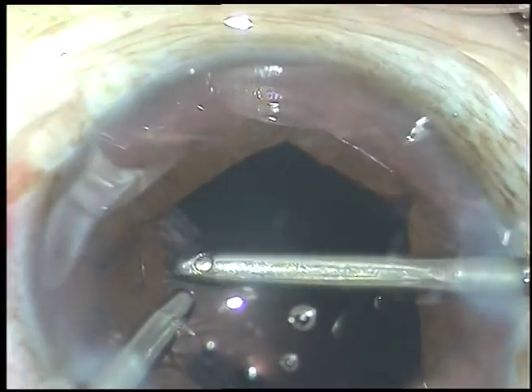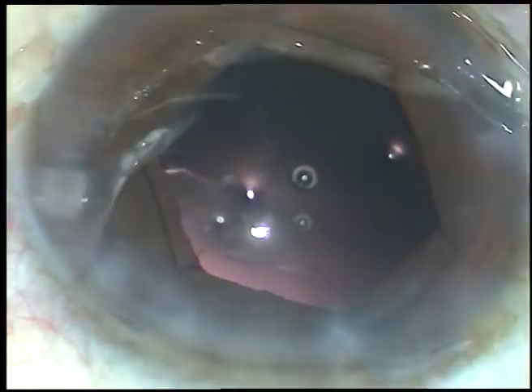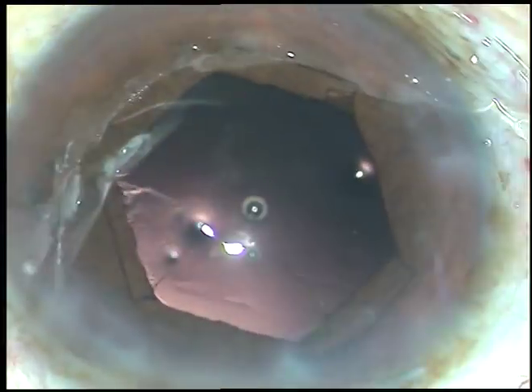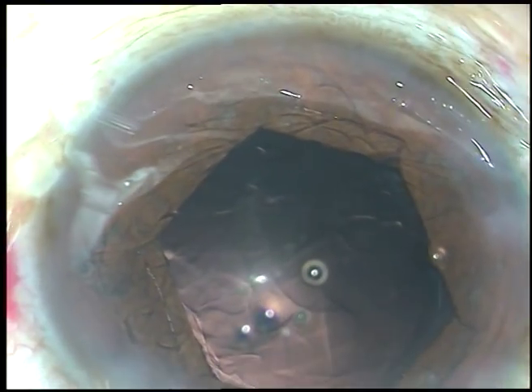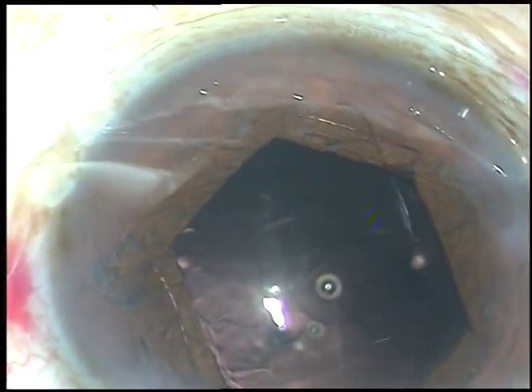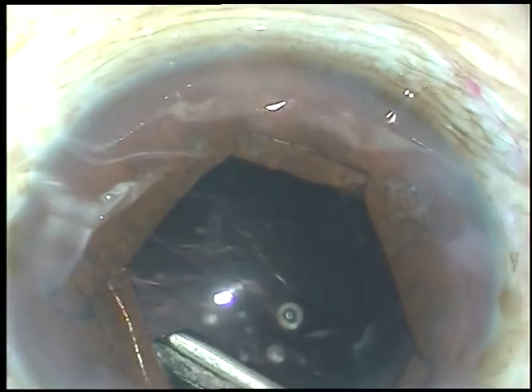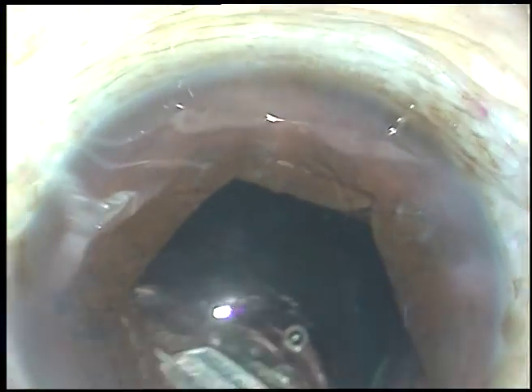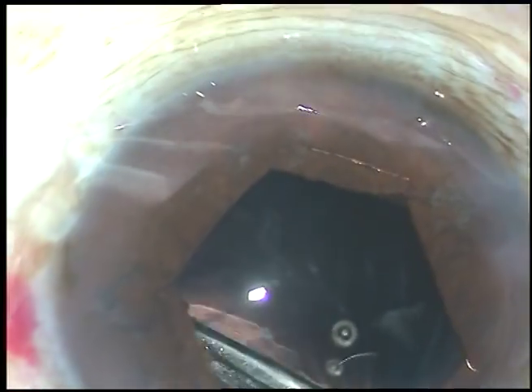Here I see that I am catching the iris and could not remove the cortex nicely — the portion which is underneath the iris. So I inject some more viscoelastic substance and ask for a 23-gauge Simcoe. Going underneath the iris, gently holding the cortical matter and removing it. The cortex is now nicely removed.